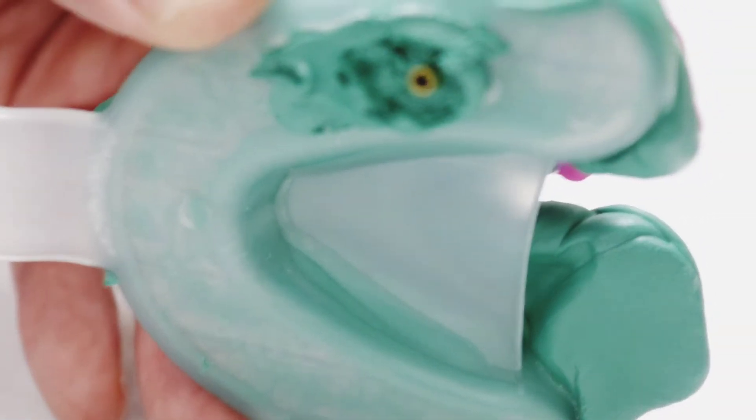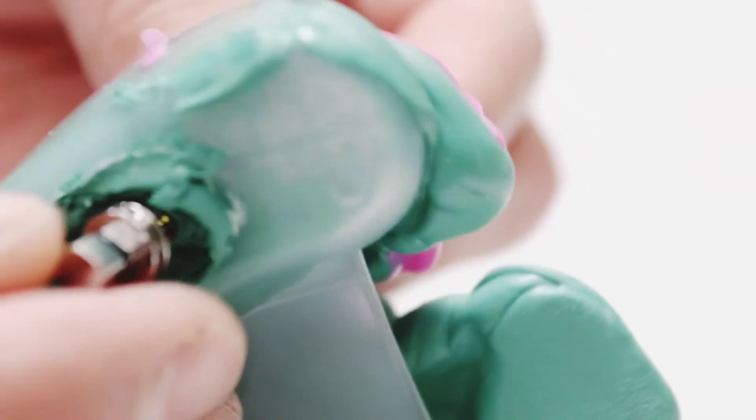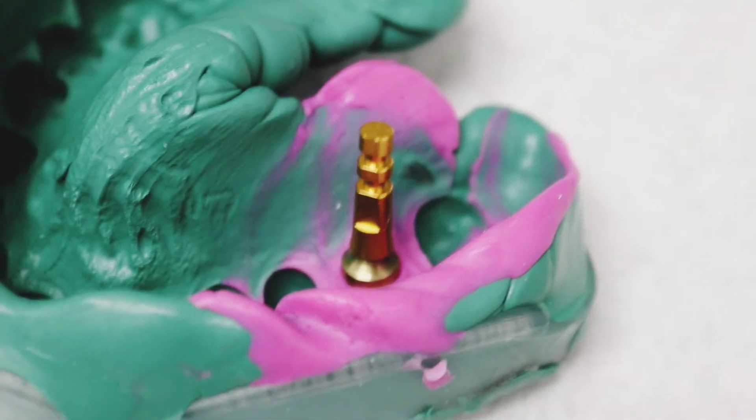Here you can see the impression turned out really nice — we got good adaptation of the PVS material. We're going to add the lab analog to the impression. I use Implant Direct; this is the Interactive system with a conical connection. I make sure it's seated fully over the hex of the conical connection, then tighten it up. I hold the back end of the lab analog with my left hand and tighten the screw with my right hand, because you can move it slightly within the material. It looks good — the analog is in there nice and tight.